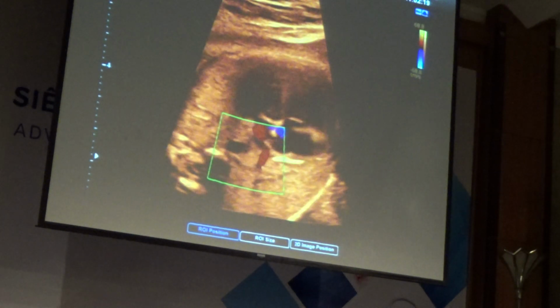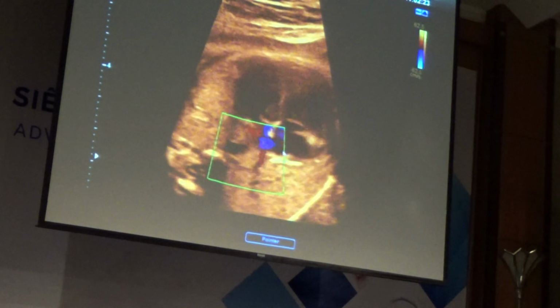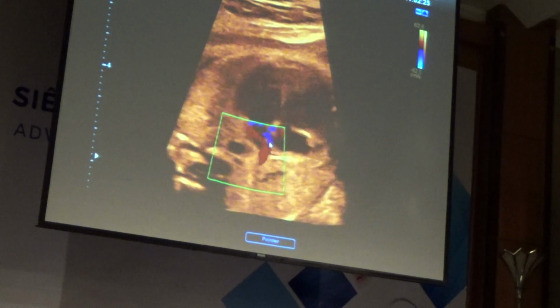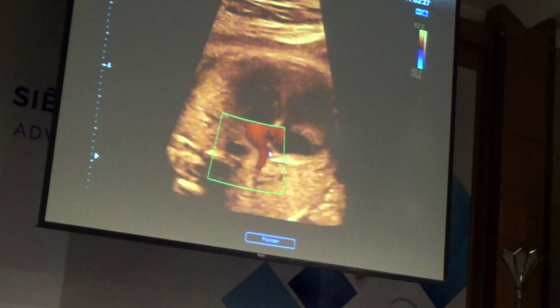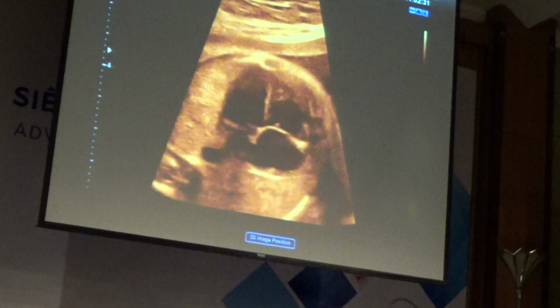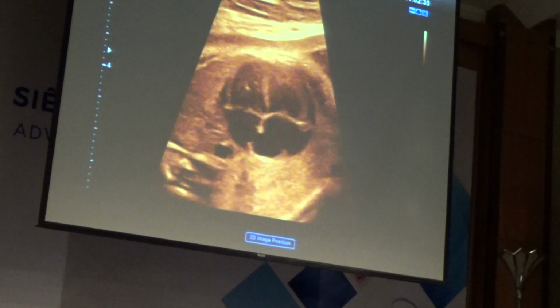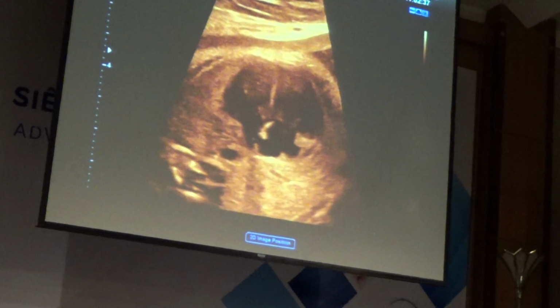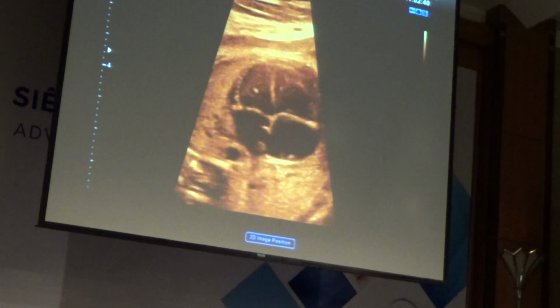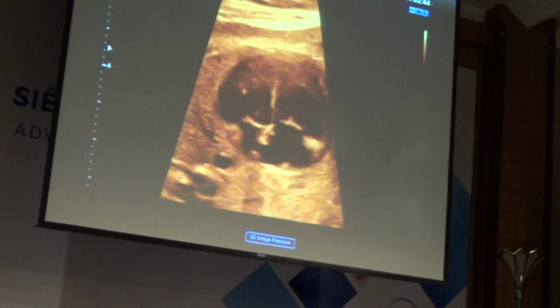And I'm lowering the scale over here, a little bit lower to see beautiful flow. And the other thing from here is we can see narrowing the sector to optimize it, zooming up.